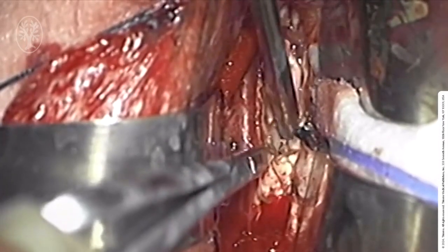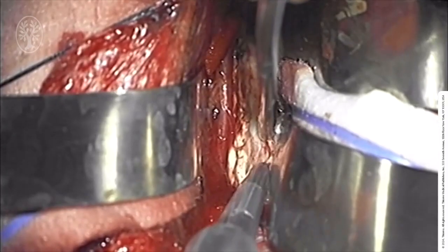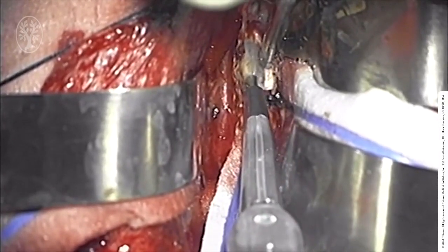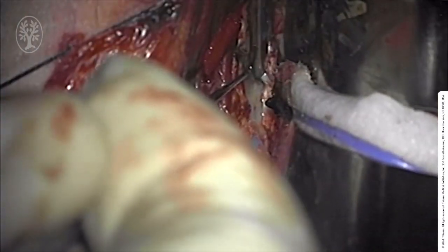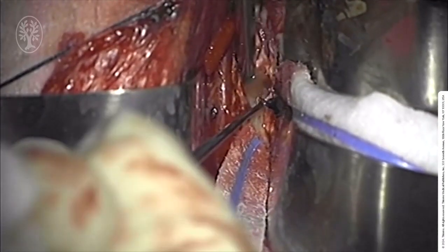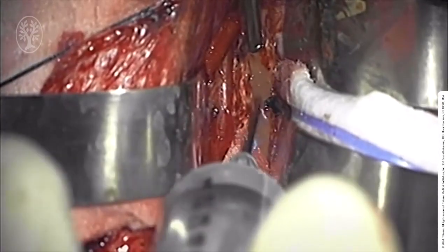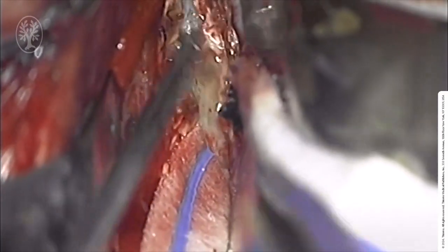Our dissection has led into the right lateral ventricle. We immediately encountered the septum pellucidum and cyst wall bulging laterally into the ventricle. In order to improve visualization, we fenestrated the cyst wall, which released thick mucinous fluid. This fluid was then aspirated to encourage collapse of the large cyst.